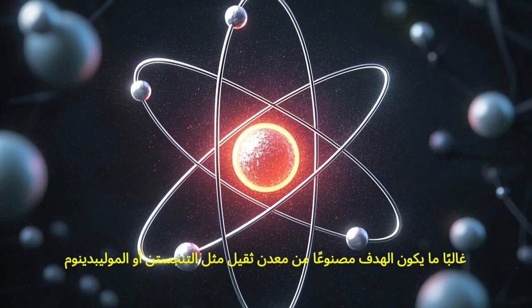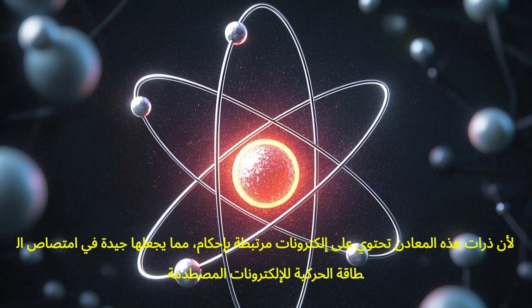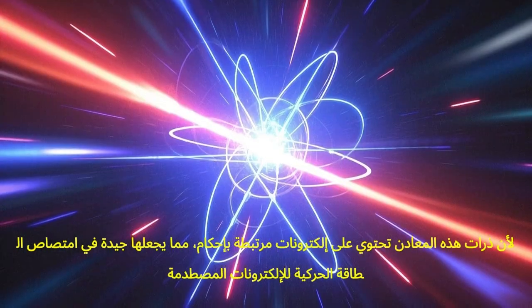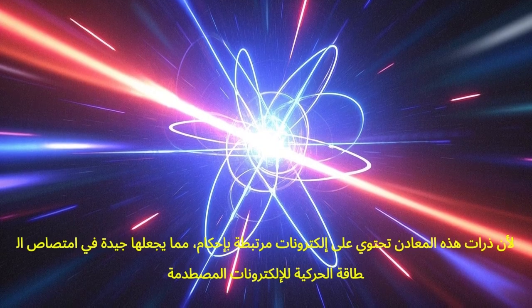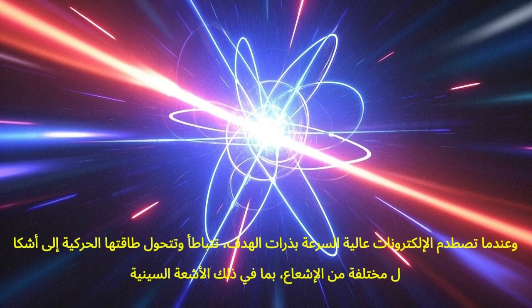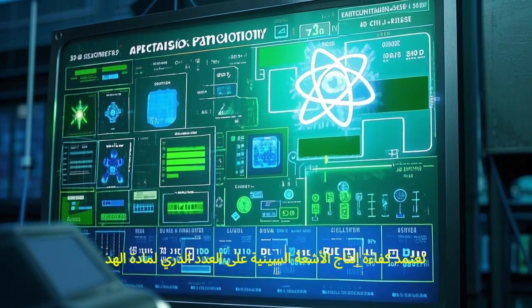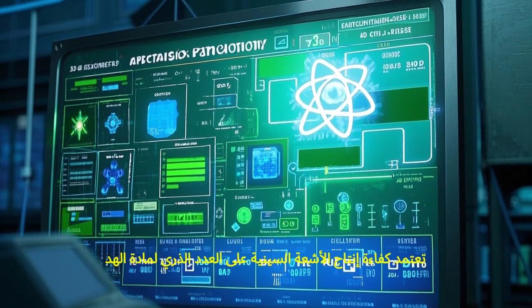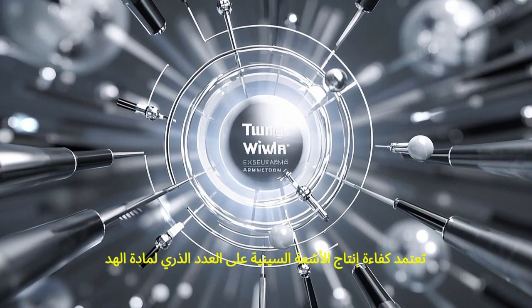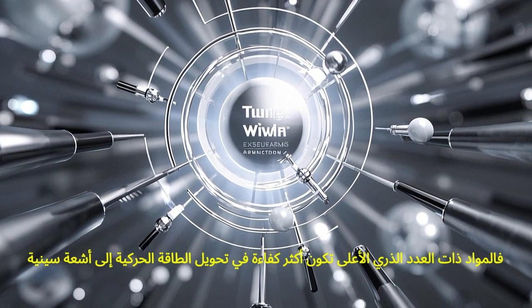The atoms in the target have tightly bound electrons, making them good absorbers of the kinetic energy of the incident electrons. As the high-speed electrons collide with the target atoms, they slow down, and their kinetic energy is transformed into various forms of radiation, including X-rays. The efficiency of X-ray production depends on the atomic number of the target material. Higher atomic number materials are more efficient at converting the kinetic energy of the electrons into X-rays.